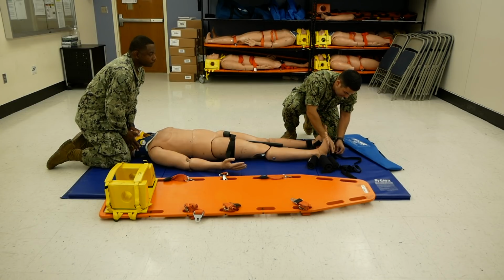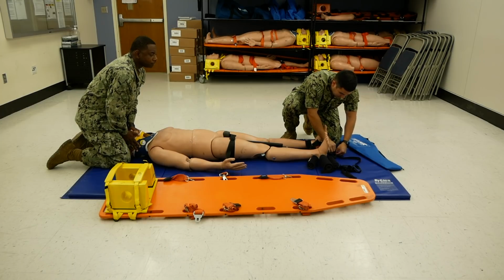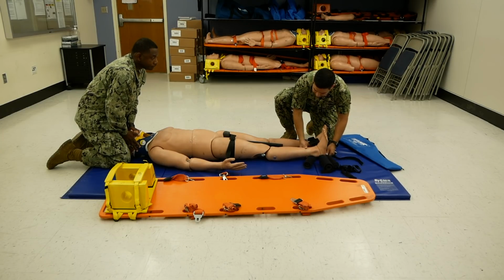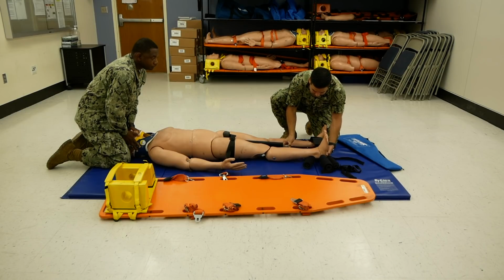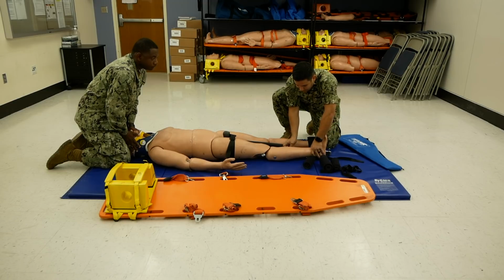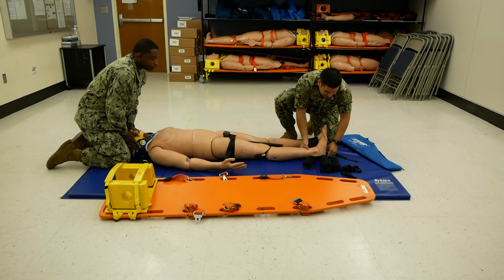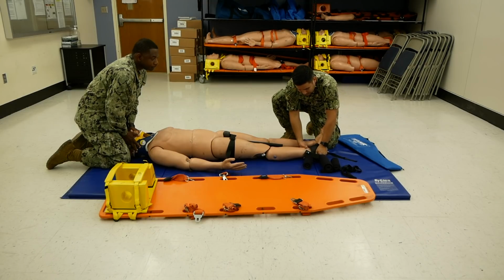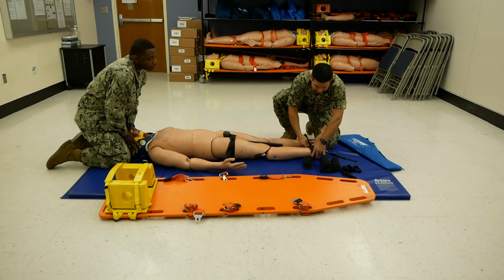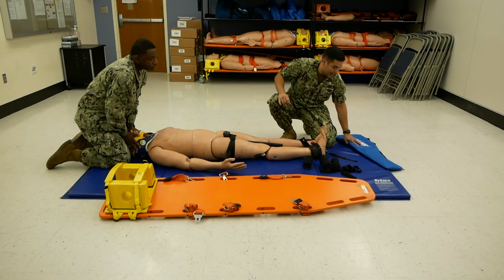Go ahead and hook in the loop part, and then place the large pad behind the patient's ankle. You may have to slightly release the spring clip to properly position the ankle strap. Then go ahead and secure that snugly around the patient's affected ankle.